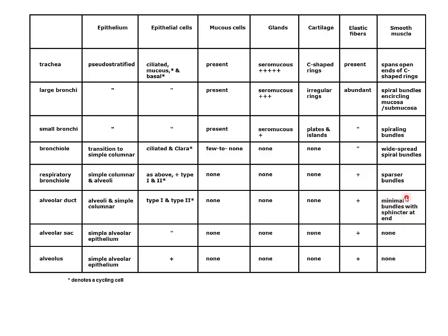Remember, it's just the knobs that we see at the beginning of our alveolar ducts. Epithelial cells, here's our typical ciliated that we see in the trachea. When we get to our bronchioles, we have the ciliated, but those dome-shaped Clara cells. Then as we get into our alveolar ducts, alveolar sac, and alveolus, we have our type 1 and type 2. That should be the same there, type 2 pneumocytes.